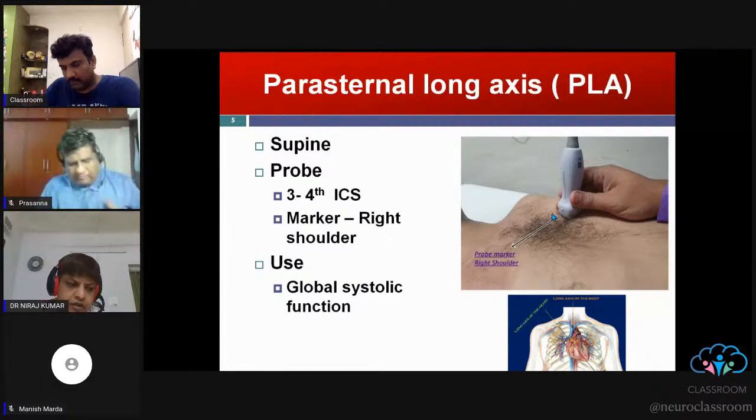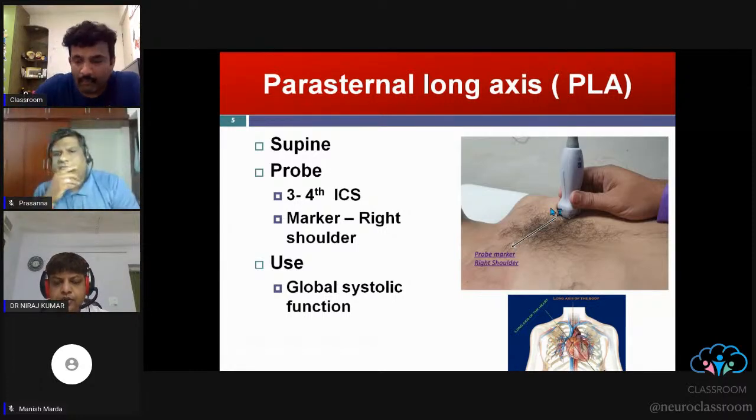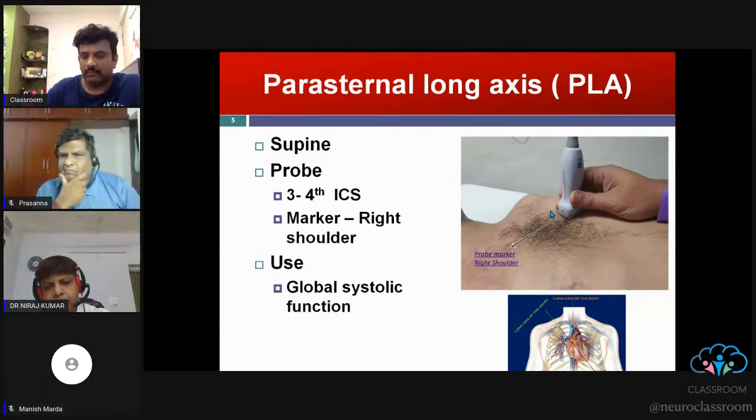But remember that some people are doing just the opposite of that. But to avoid any confusion, I'm just using this convention. But remember, sometimes it is confusing.